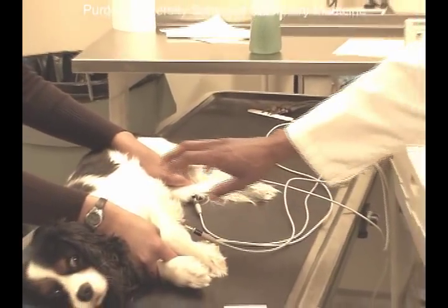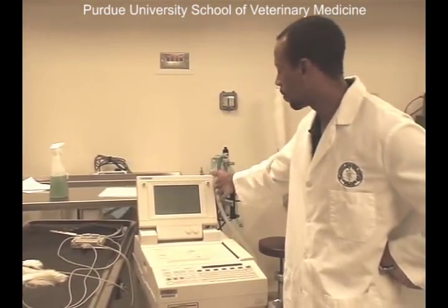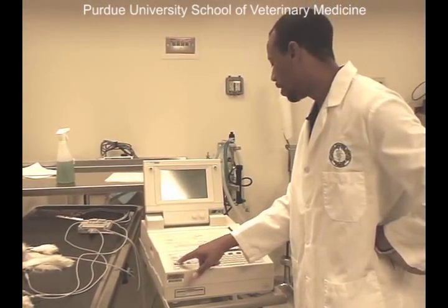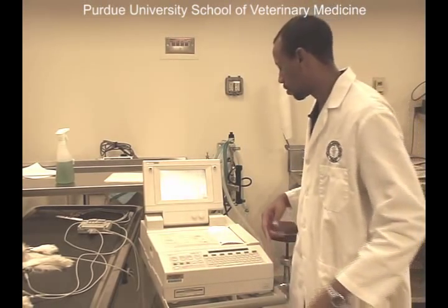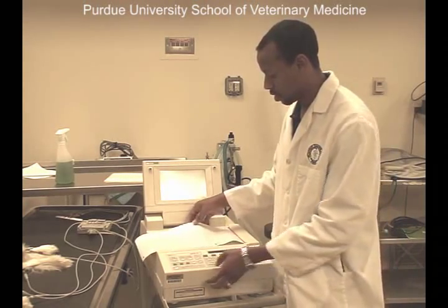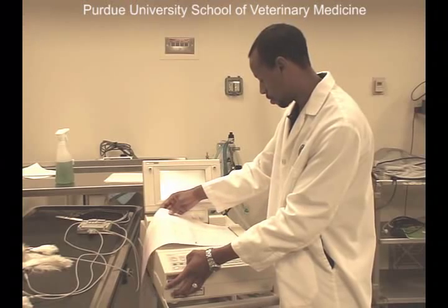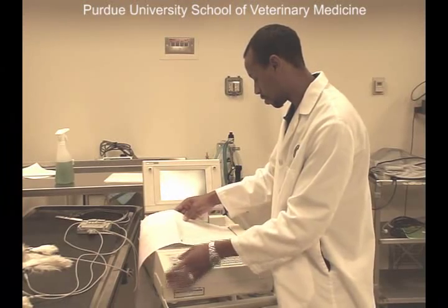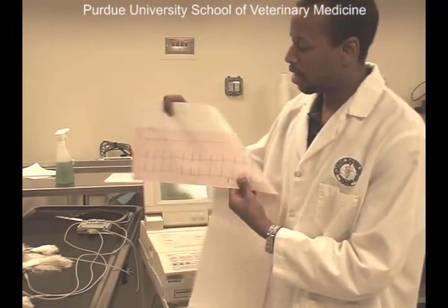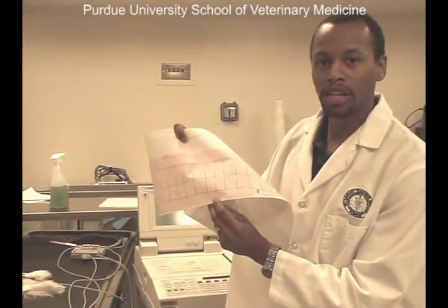Our electrocardiogram would then record the small electrical activities that are occurring in the heart and amplify it so that we can see it on the screen here. We can then print out a copy of Ozzy's ECG. Similar to the diagram that we had earlier, you can see we have the waveforms that demonstrate all of the electrical activity occurring in Ozzy's heart in order to stimulate it.